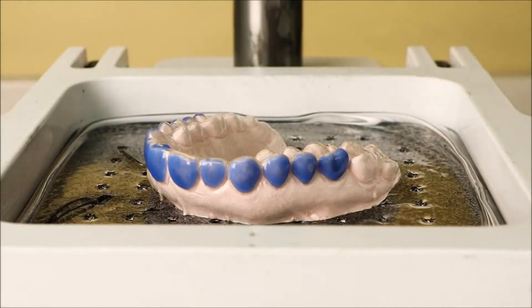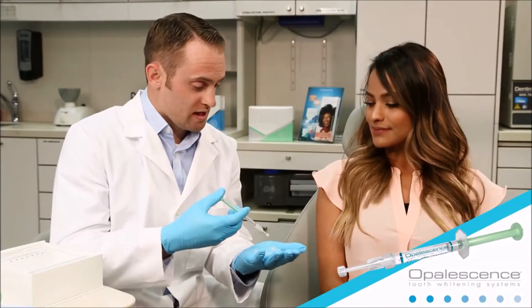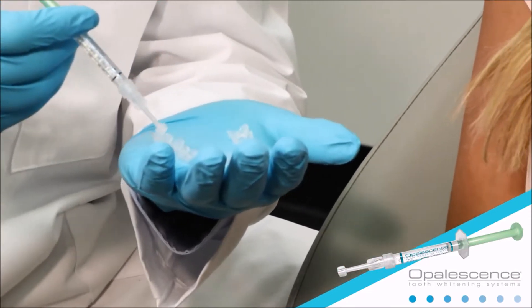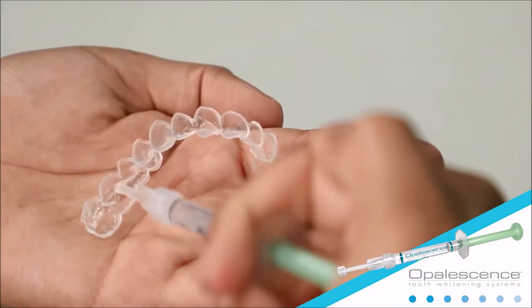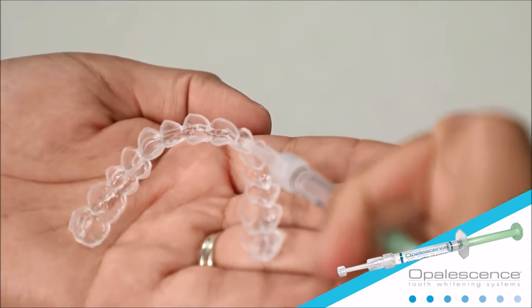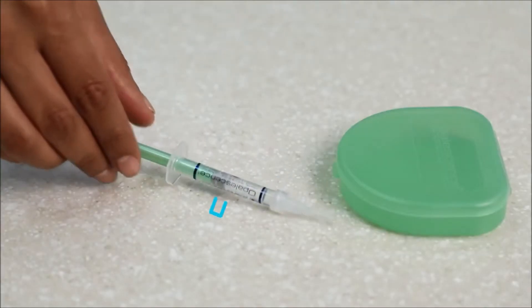Once the trays have been fabricated, you can begin treatment. To load whitening gel in your custom tray, begin by expressing one continuous bead of gel approximately halfway up from the chewing surface on the front side of the tray from molar to molar. This should use about one-half to one-third of a syringe in each tray.